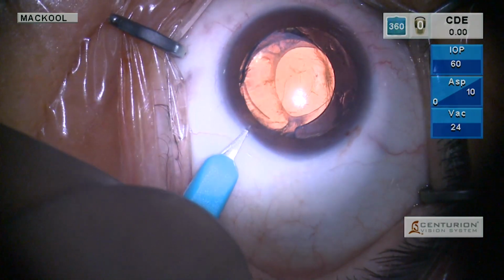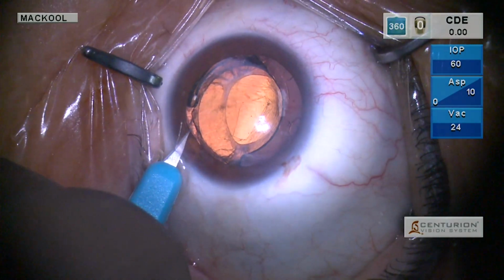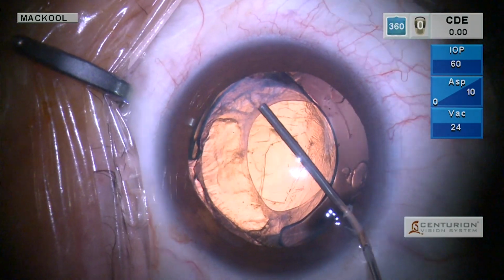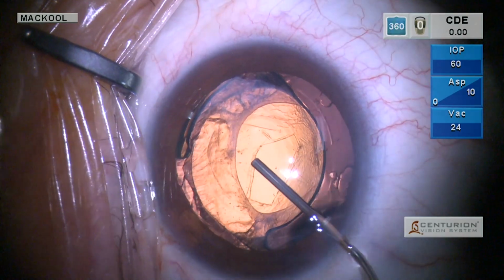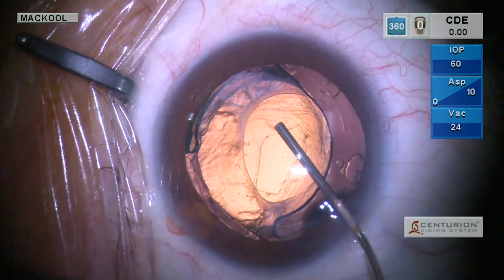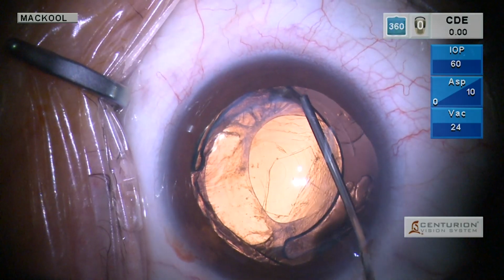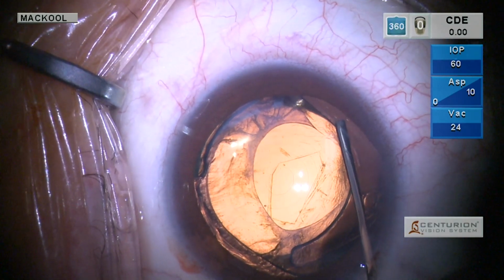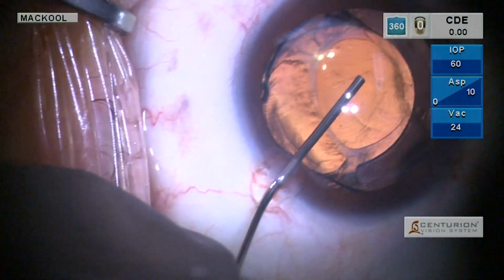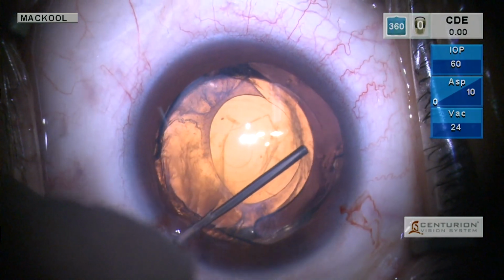As the procedure begins, I'm making a side port entry here at around 4:30 o'clock, and I have a side port opening supratemporal, so I'm filling the anterior chamber with OVD here, and I can get underneath the capsule here and inject OVD, and it's dissecting around nicely, separating the capsule and fortuitously not headed toward the posterior capsulotomy opening. So let me just continue that and go around in that direction.